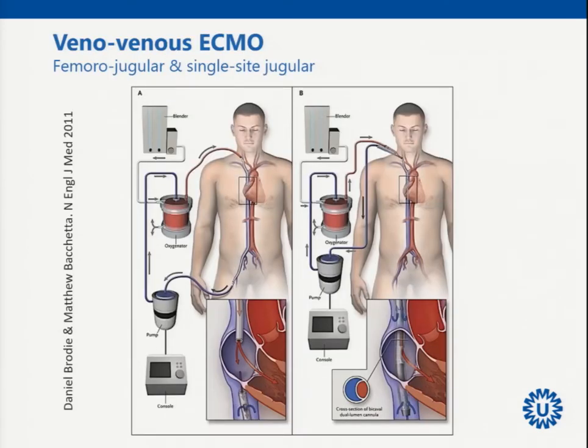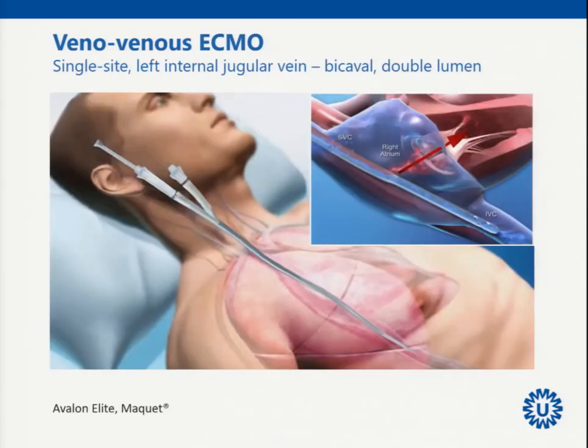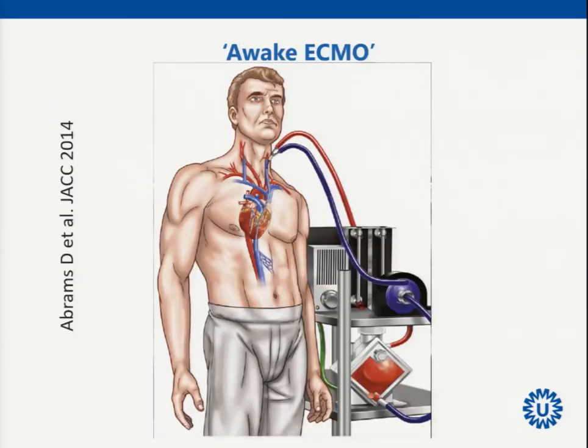So veno-venous, femoro-jugular and single-site cannulation, as I told you, but the single-site cannulation is not trivial. You can see that the positioning of the cannula with this infusion port exactly above the tricuspid valve is very, very crucial. So echocardiography is very crucial.